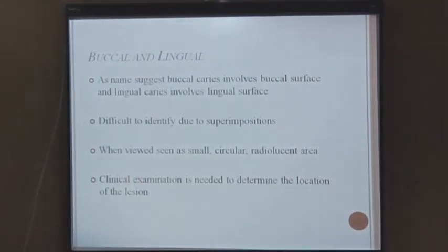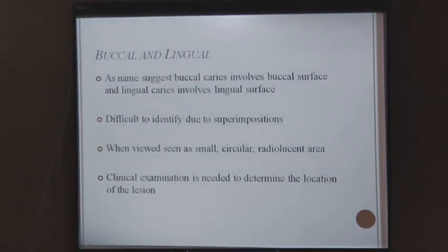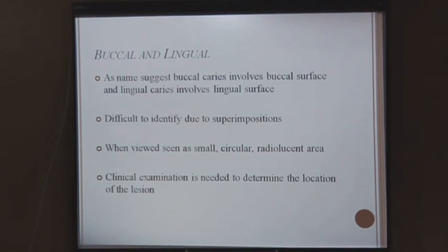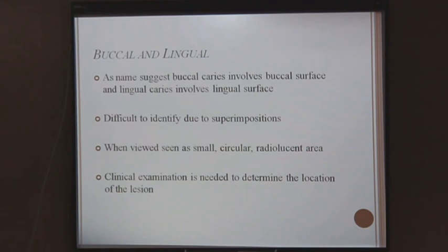How will you distinguish whether a DC is buccal or lingual? You can't differentiate whether the restoration is on the buccal or lingual side. The SLOB rule is only for object localization. That's actually a confusing question.